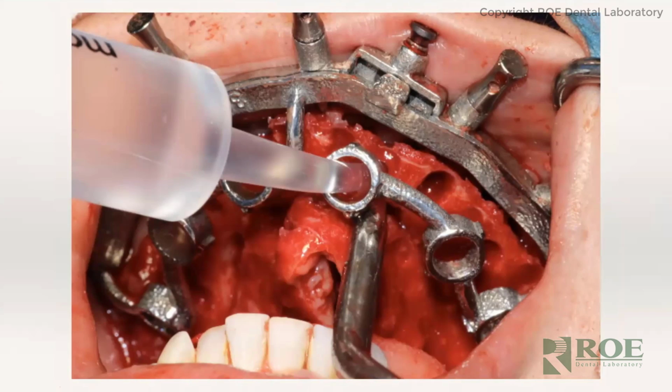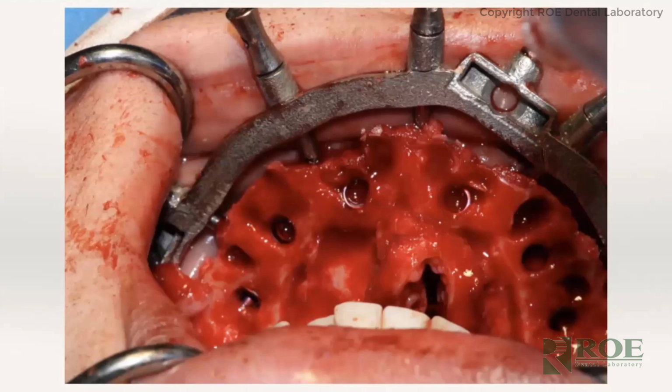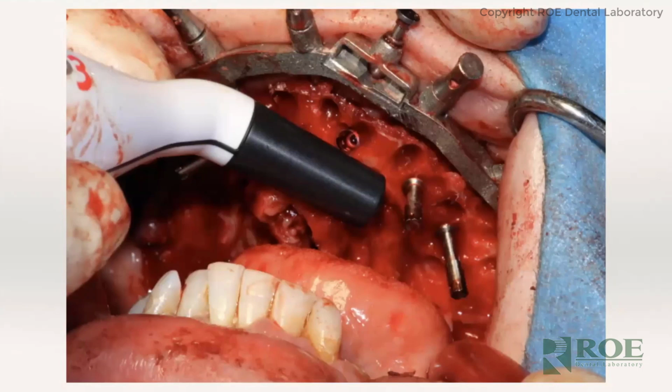And so when I get a feel for that bone, I want to make sure that we have the right torque into place. I want to have at least 72 on our ISQ when we're doing our readings, if at all possible. So we're placing our implants in the undersized osteotomies. Take a look here. I'll always do bone profiling afterwards. It makes it much easier when we're placing our cylinders and the MUAs. We've got our Penguin in place here, checking our ISQs.